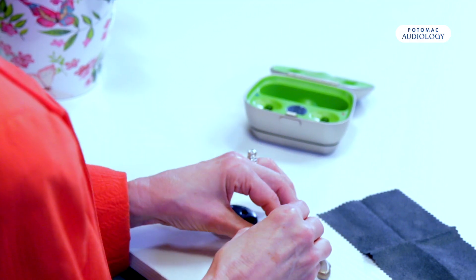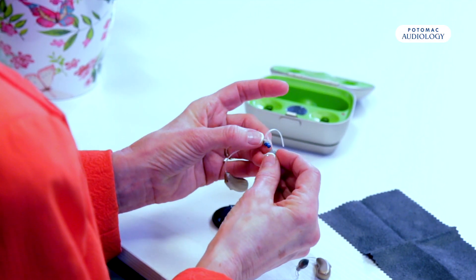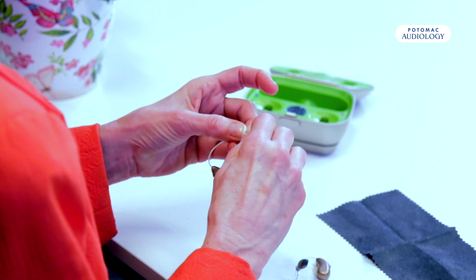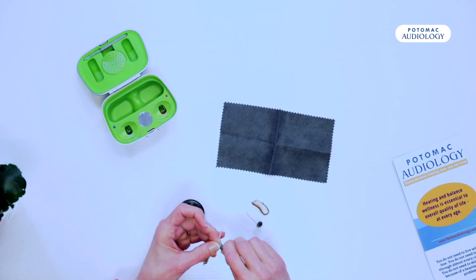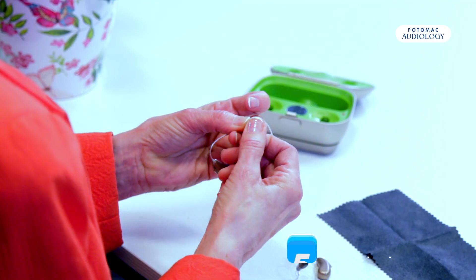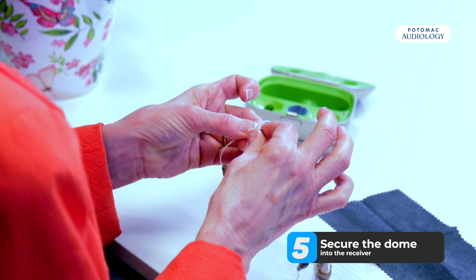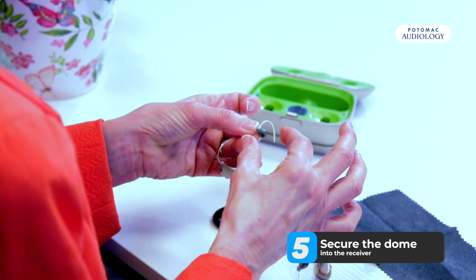Inside of the dome is a little round circle — if we insert the receiver in there, it will go into the circle and that holds the dome onto the receiver. You want to make sure that you have this on securely because if you don't, it could come off and stay in your ear.